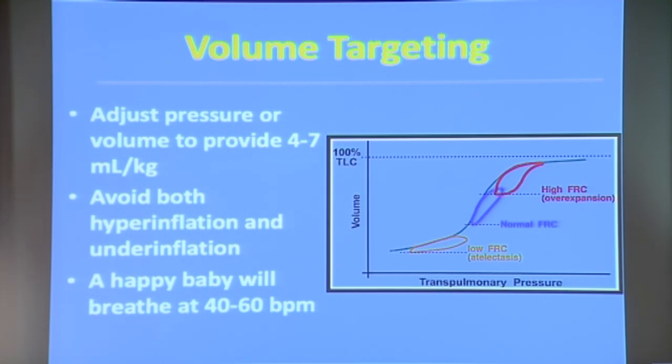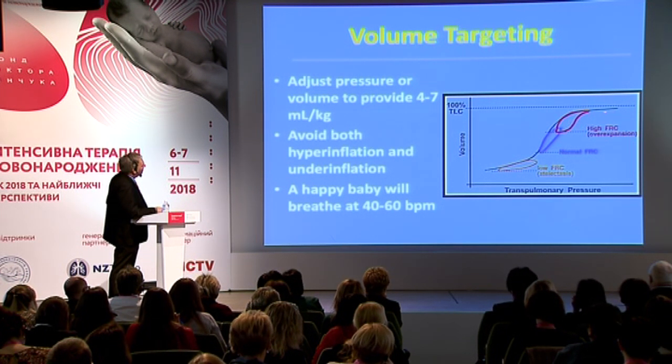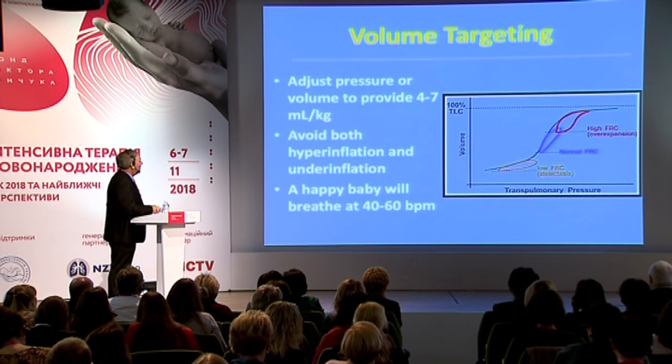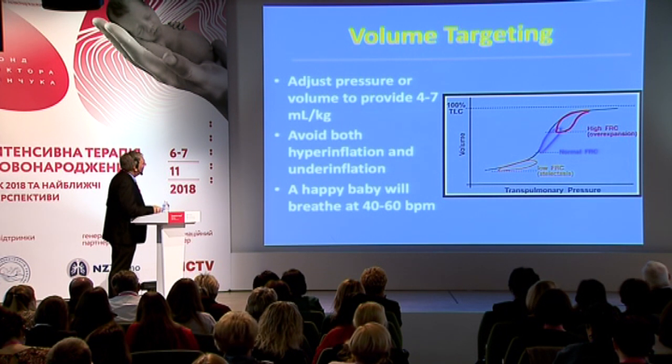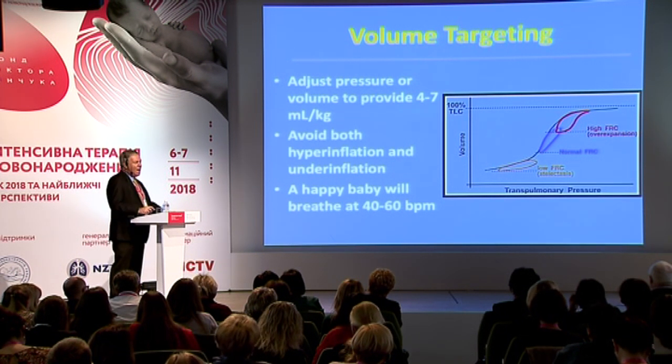So if we're ventilating with too high a pressure, we're in the zone of overexpansion and potential lung injury. You can see that our loop is bending at the top of the curve towards the right. Conversely, if we're ventilating down here, we're not giving enough expansion to that lung. You see how flat our compliance axis is, and this is in the zone of atelectotrauma.